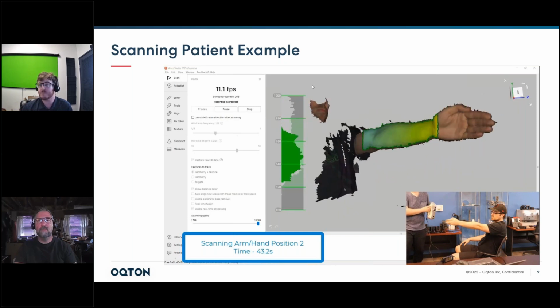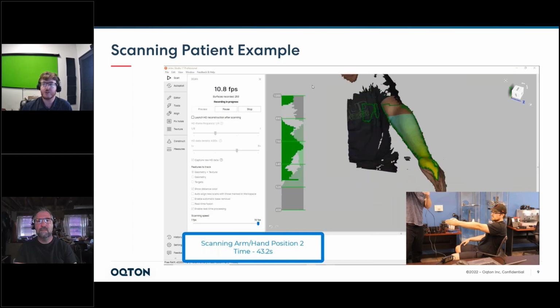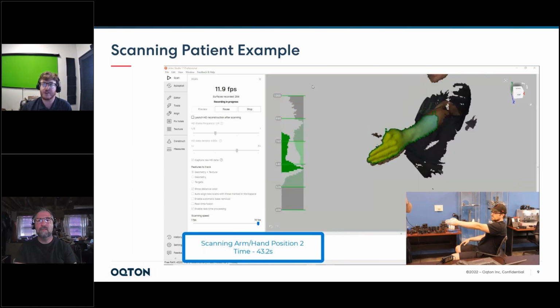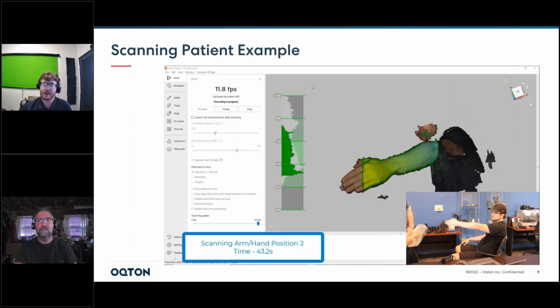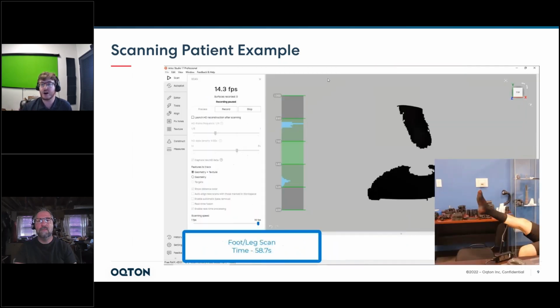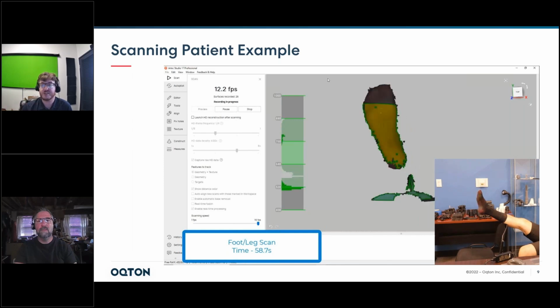And depending on the body part you're scanning, you can create different setups for it. So we're just walking around the patient again, trying to get good coverage of everything, multiple angles, multiple positions, just getting that full coverage. And this is essentially what would be represented by making a mold, but we're doing it in a non-contact scanning form. Do the same with scanning a foot.